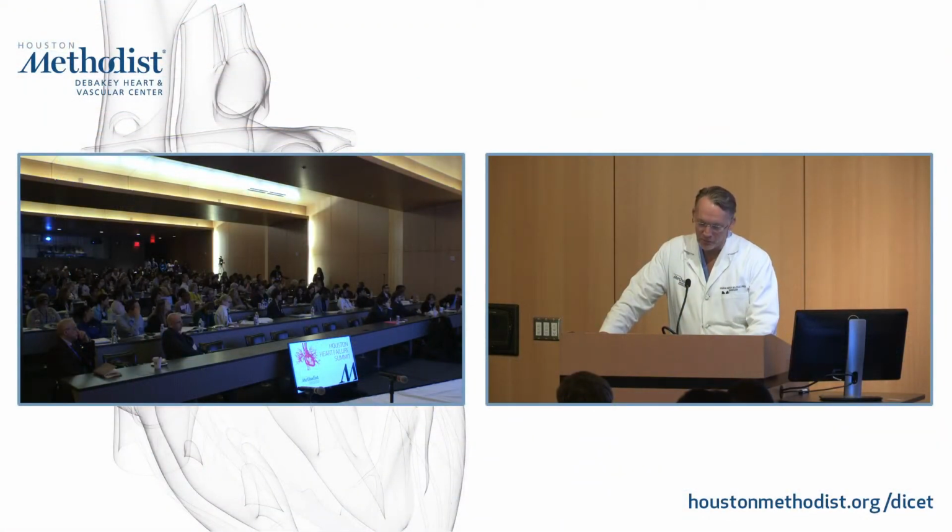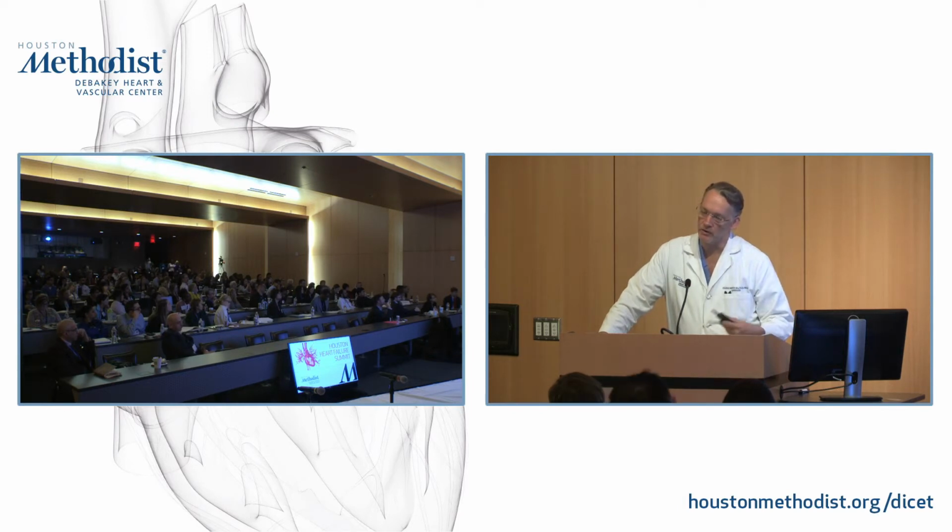Yep. So there's a couple things we do. When we put it on, we go through a couple of test maneuvers to make sure we have enough tissue and it's not going to come off. But that being said, when you look at the TVT registry, there's a 1.3% what we call single leaflet detachment, which is where it does pull off. And so that's problematic. Obviously, usually they need to go for surgery or a redo intervention, but it's about 1.3%.